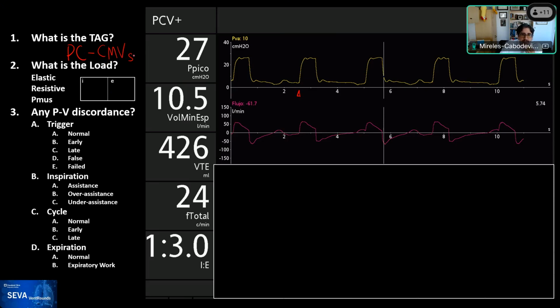And finally, set point stands for the targeting scheme, meaning how the computer in the ventilator controls the breath. And set point is the most basic targeting scheme, and essentially you, the operator, have entered all the variables. So you have said how high the pressure is going to be, how long the inspiratory time is going to be, how frequent the breaths are going to occur. And so that's what set point stands for. And so in this case, it's pressure controlled CMVS.